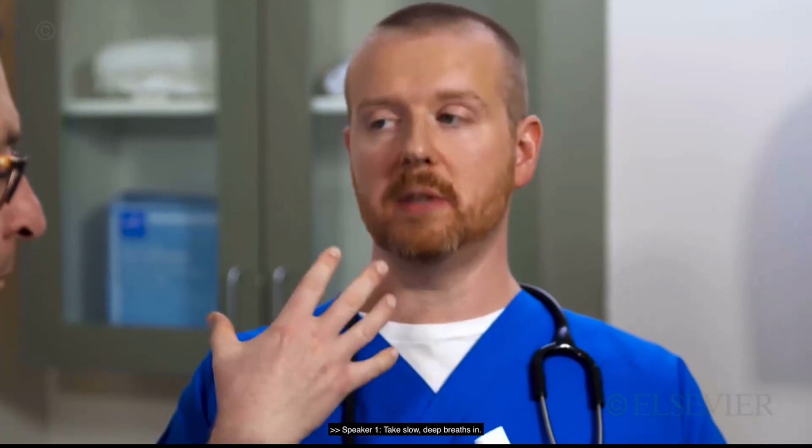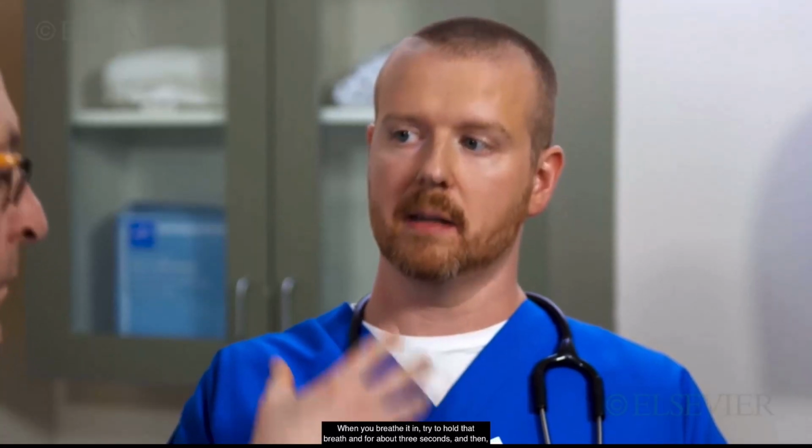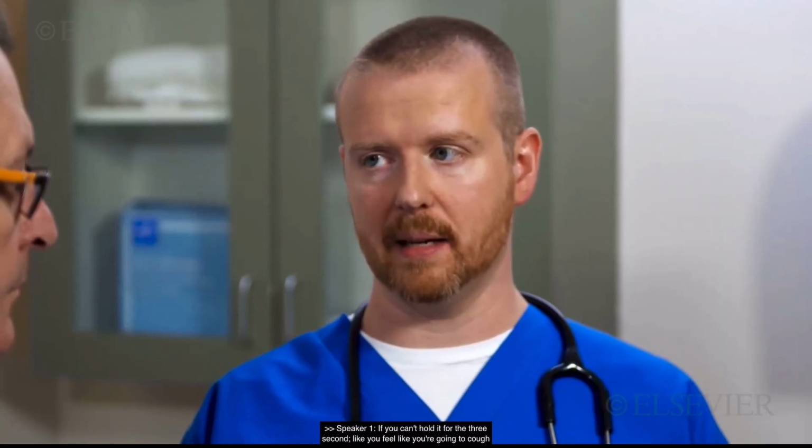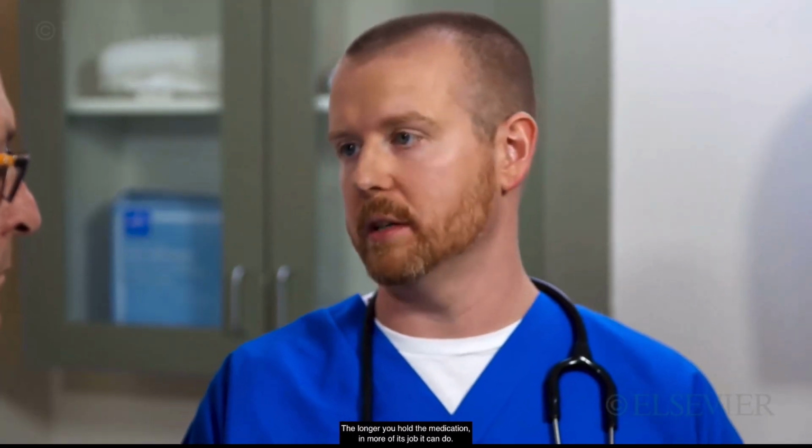Take slow, deep breaths in. When you breathe it in, try to hold that breath in for about 3 seconds, and then slowly let it out through your nose. If you can't hold it for the 3 seconds, like you feel like you're going to cough or you're short of breath, it's okay, just let it out. The longer you hold the medication in, the more of its job it can do.